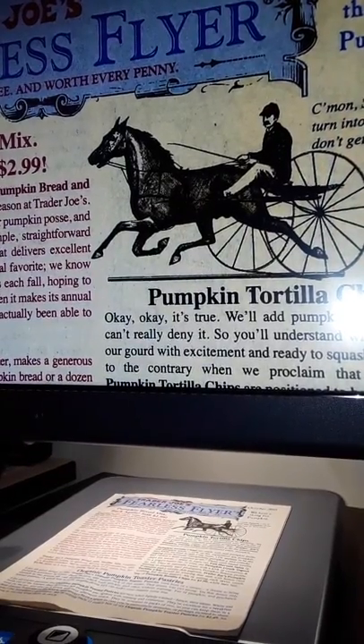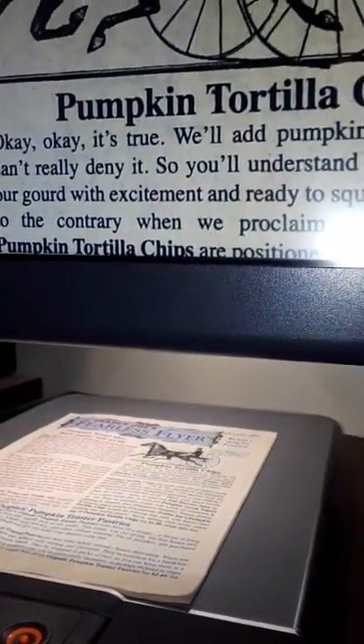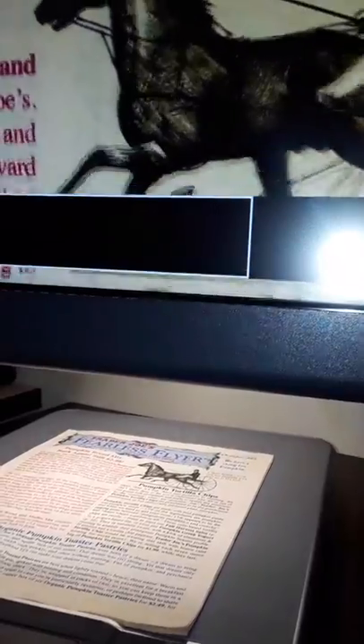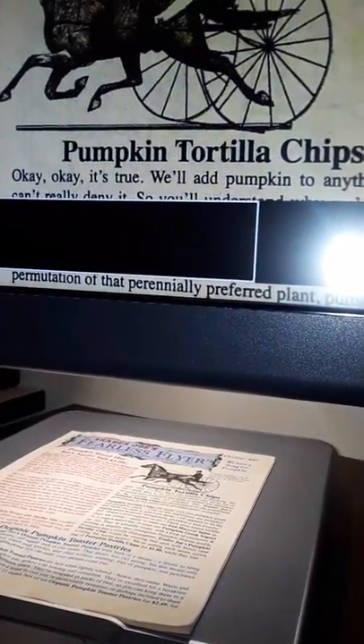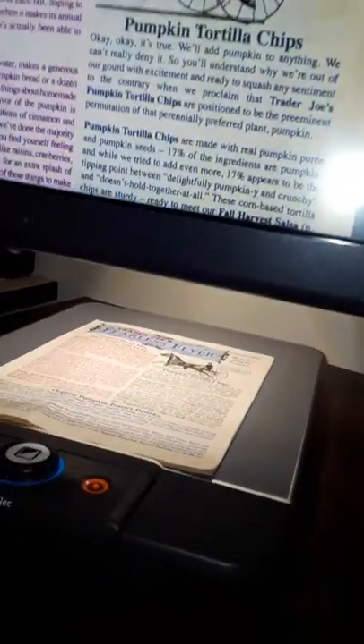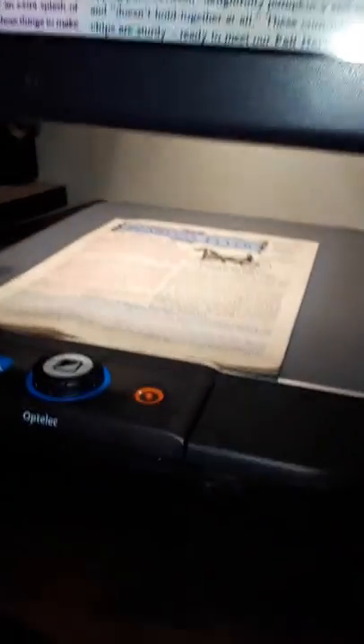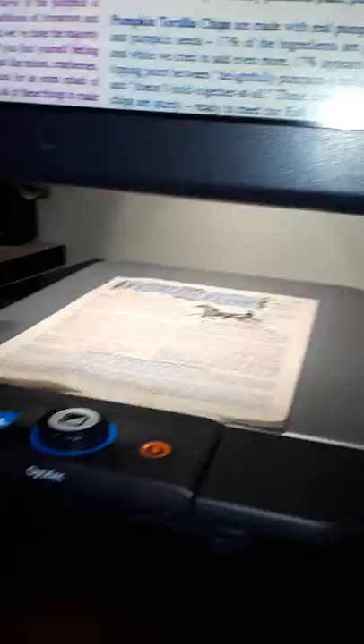If you need to increase the size of the type, you can do that. The way that you do that is by rotating the outside ring on the master dial. This is the type of gear you can get only if you have an honorable discharge from the military. So, now, can you read this text right here?